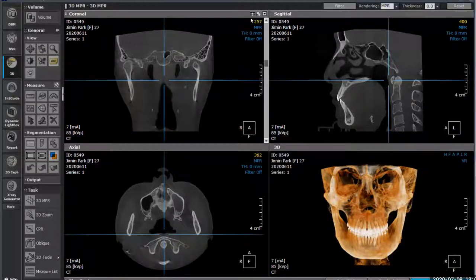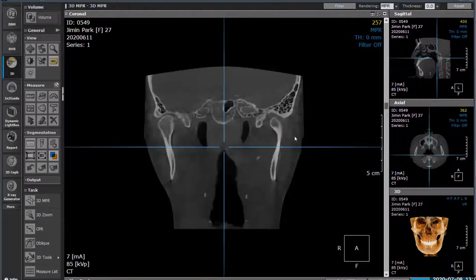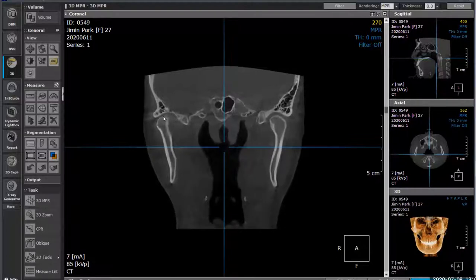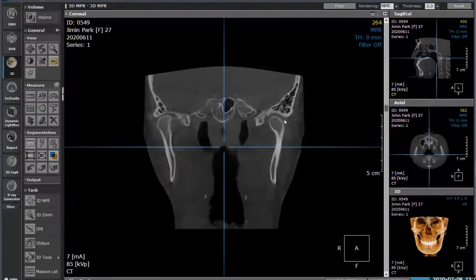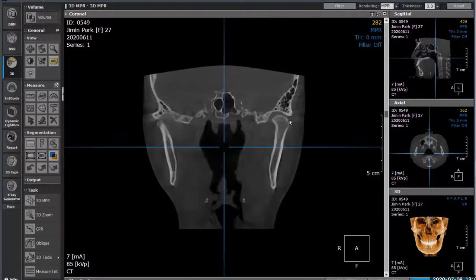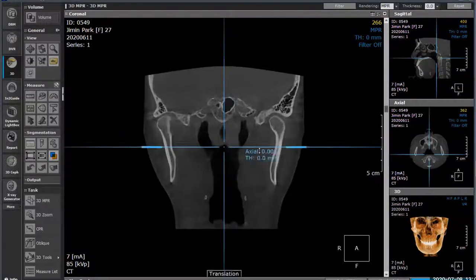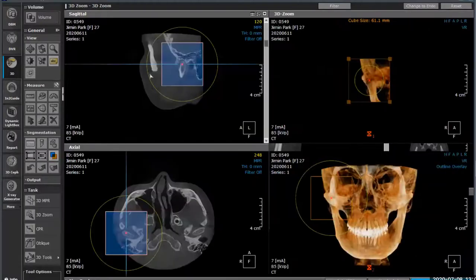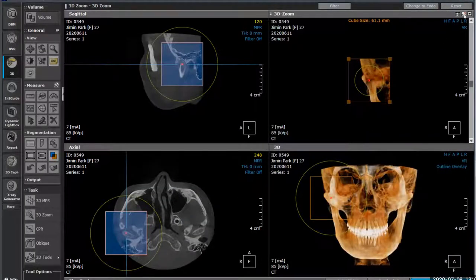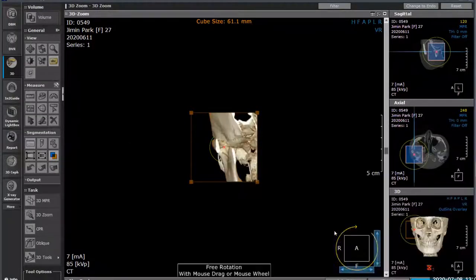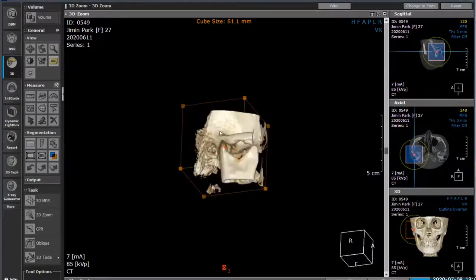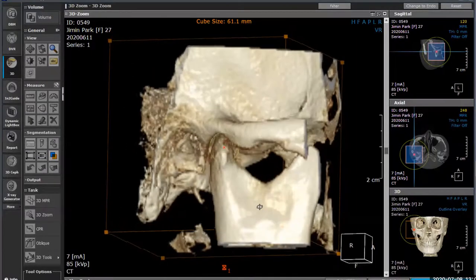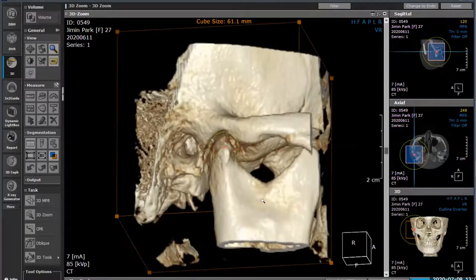As we scroll through, you can see the joint space is a little bit narrowed on this side as opposed to this side, which seems to have healthy joint spaces. This is probably the best view for seeing bilateral TMJs in the diagnostic view. We also have tools for a 3D zoom - create a box and maximize it. Changing the bone window to teeth, this allows us to look at a 3D view of just that section and see how the joint space is.